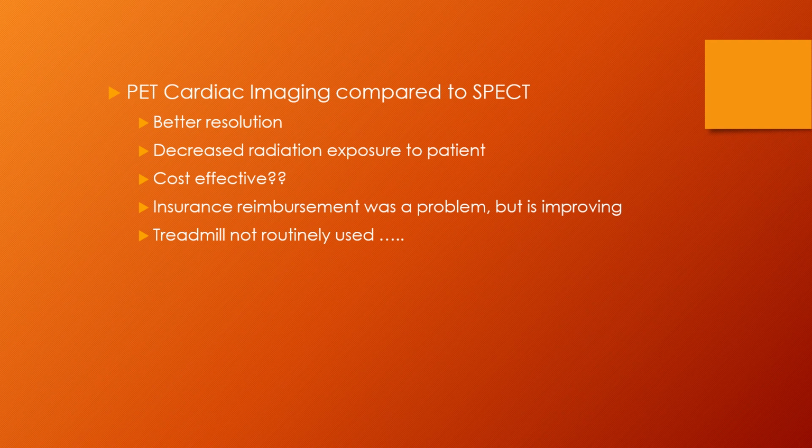And then the treadmill is not routinely used. Flurpiridaz may change that, but for now, the rubidium is all pharmacologic testing.